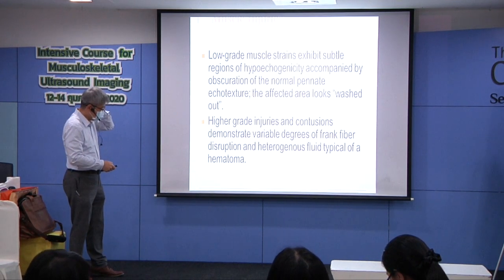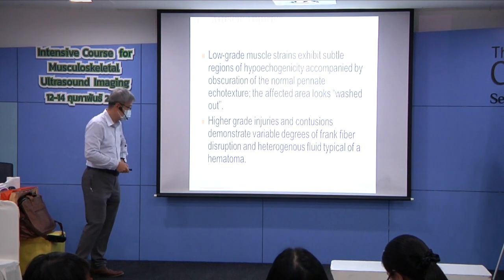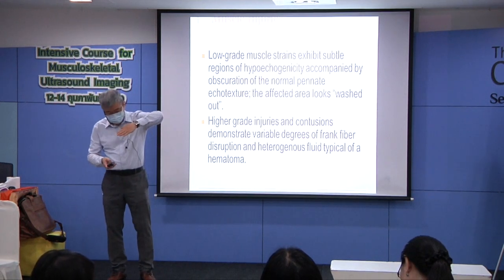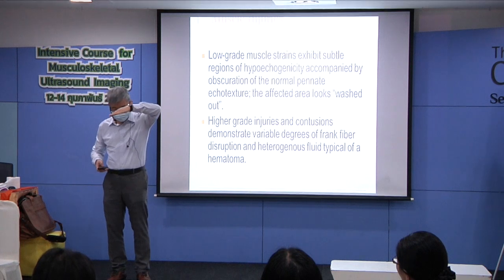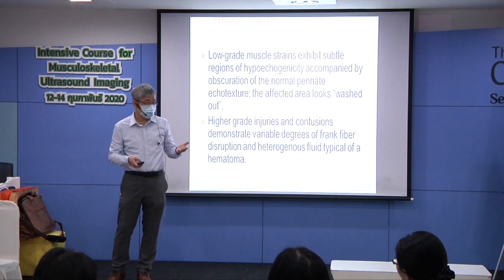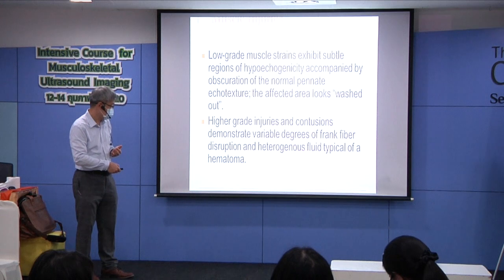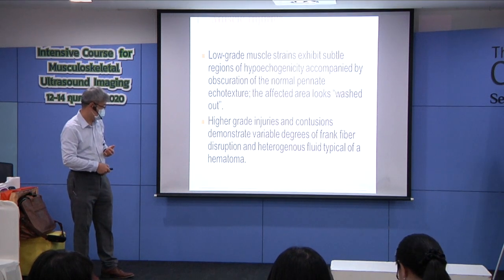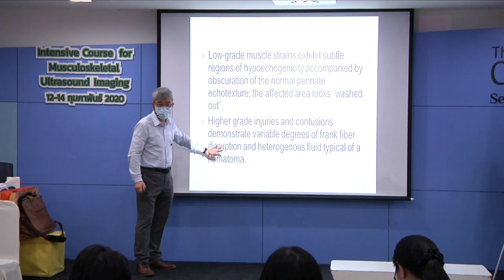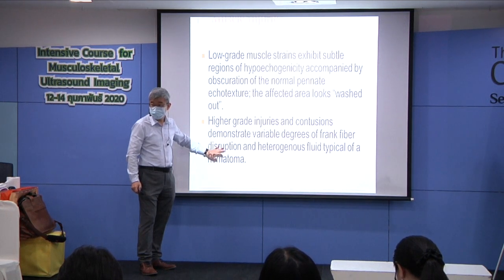High-grade injury always shows the fibers are disorganized and flat. So basically, there is an angle, pennation angle. If the pennation angle gets flat or shows no tension, that means the muscle fiber is ruptured, and there are some fluid and a hematoma. In this case, compression is the best way to deal with it.